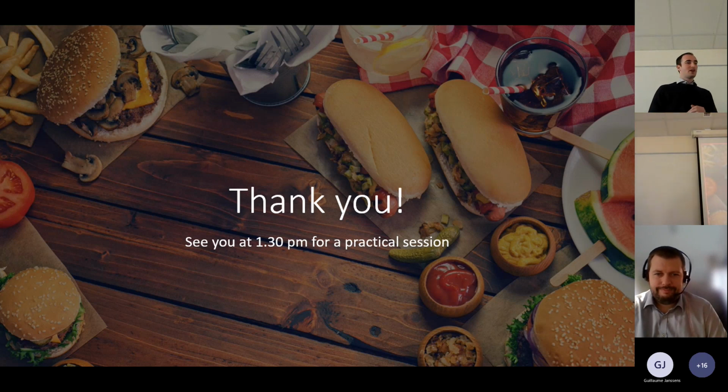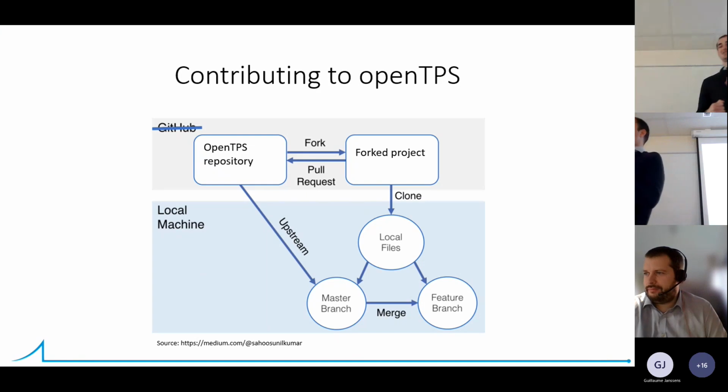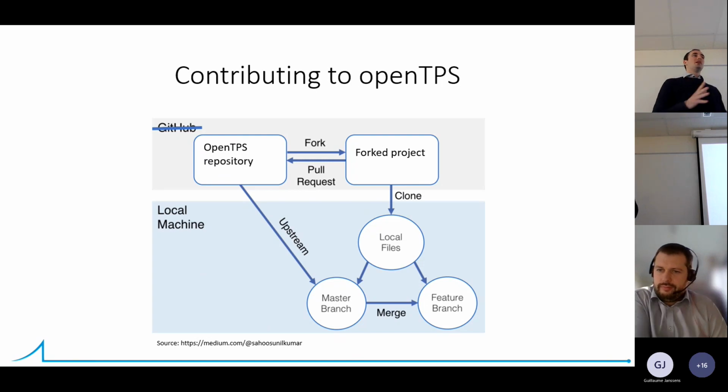Questions for the... Yes, right. Before we finish, are there any questions related to how to get started with it, how to contribute with it? This afternoon, for people who would like to attend, we will have a practical session. This means that we are in this room, so we can help you get started with OpenTPS.